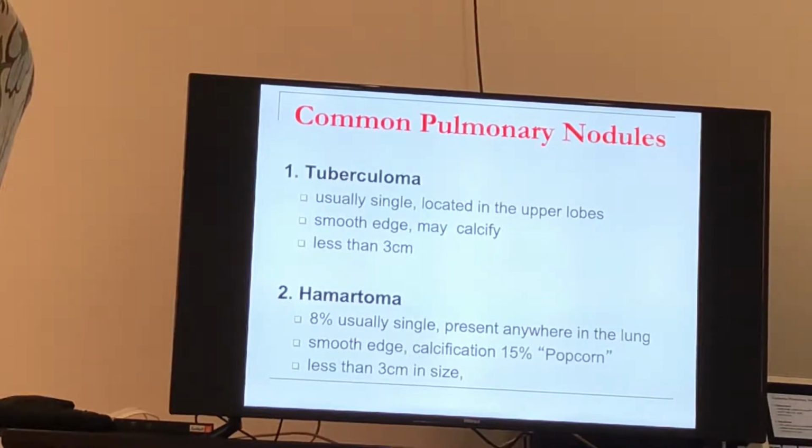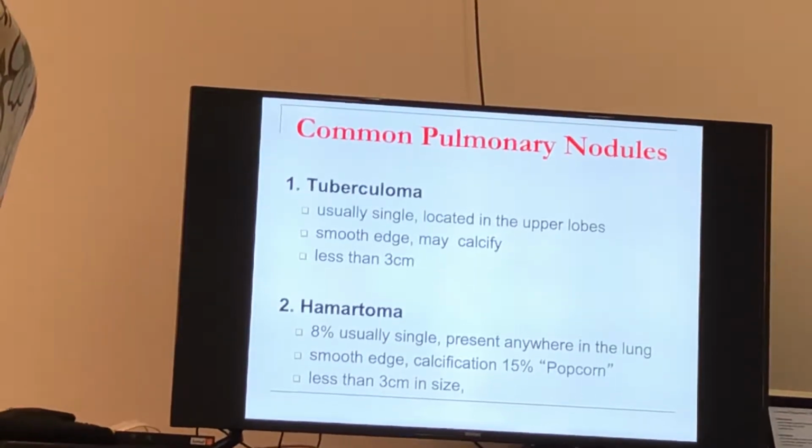Let's say you actually face an X-ray where there's a focal lesion and it's a nodule. So what's the usual differential? What would you be thinking about to generate a differential? Commonly, it could be a tuberculoma. It's very common. Something that we all go through when we get infected with tuberculous bacilli. It goes to some area in the lungs, and it becomes dormant there. And it just stays there.